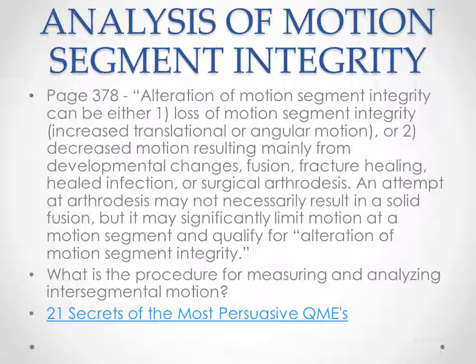And it's entitled The 21 Secrets of the Most Persuasive QMEs. So that link is available to you here now. For the rest of us, let's move forward into an abbreviated discussion of how to perform an analysis of motion segment integrity.